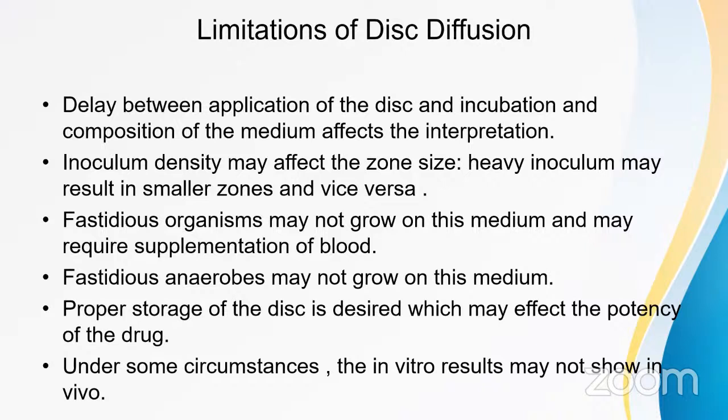So what are the limitations of using this disc diffusion method? There can be a delay between application of the disc and incubation, and the composition of the medium affects the interpretation. The inoculum density may affect the zone size. So a heavy inoculum may result in smaller zones and vice versa.